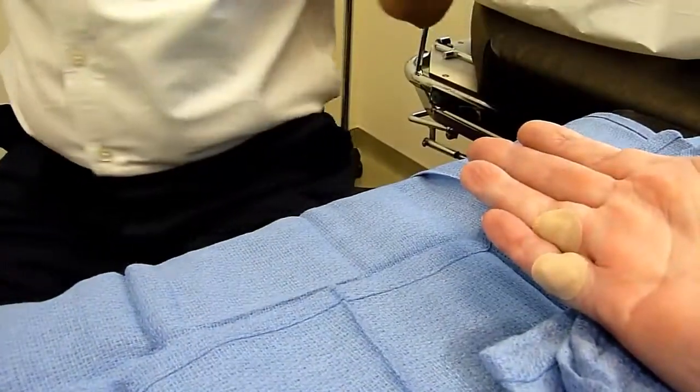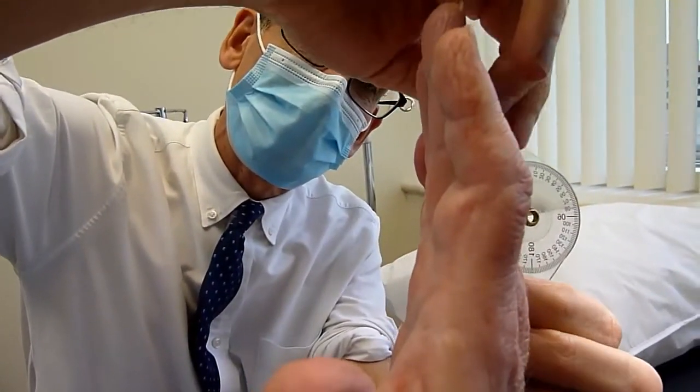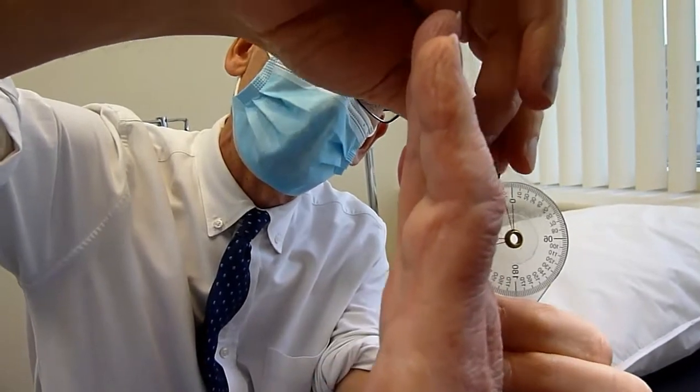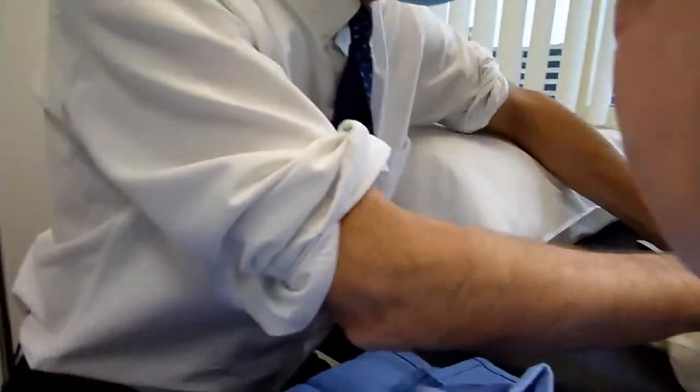Thanks. And then I'll be measuring, because we measured before, so you put your elbow up, perfect, elbow down, like we're going to Indian wrestle. And up. And then your MCP joint hyperextends 11 degrees and straighten up as best you can. Your PIP right now is at 18 degrees. So, hold on. Hyperextension of your MCP.